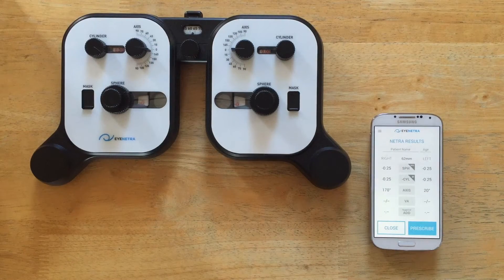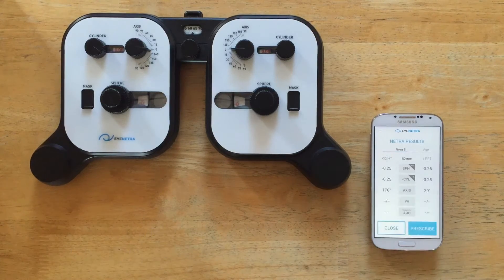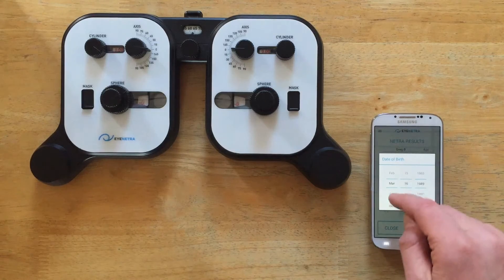So to begin, I've just run myself through a refraction using our Netra autorefractor and here are my results right here. So the first thing I want to do is tag my results so I know who they belong to. I'll start by adding my name, Greg B, and my birth date.